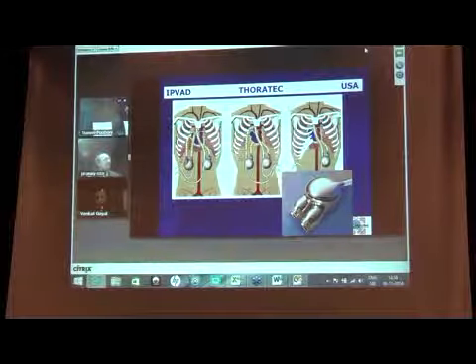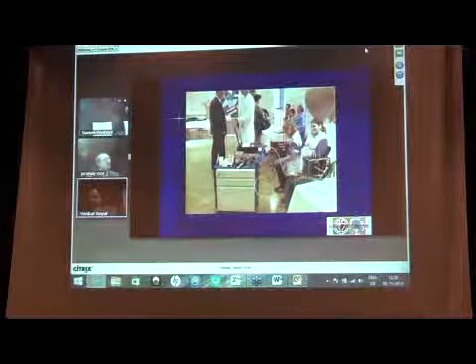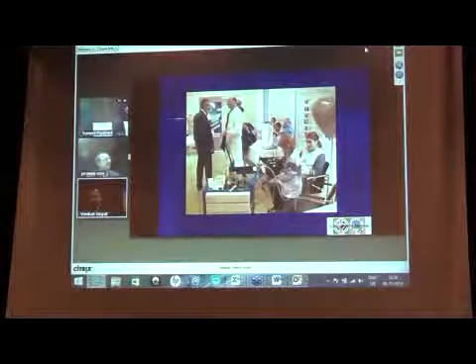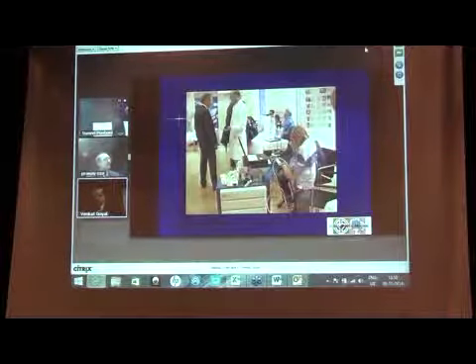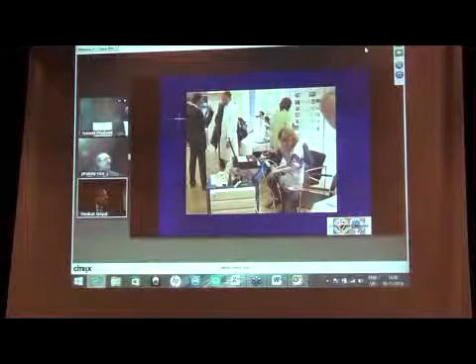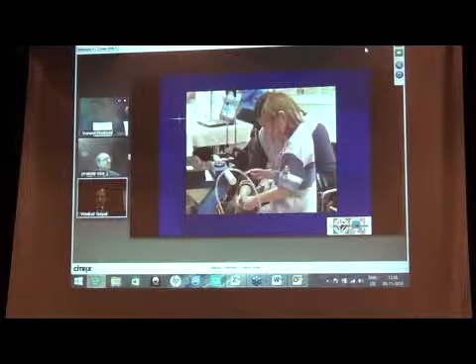Okay, this is just to show you an example. When the thing gets more compact, this is a small girl who is connected to the computer. As I said, you can analyze the cardiac status or the hemodynamic status of the patient every time, but they are stuck to a console. This is just an example to show you that this is how they were kept alive and had some quality of life with progress. This is somewhere in the 1990s.